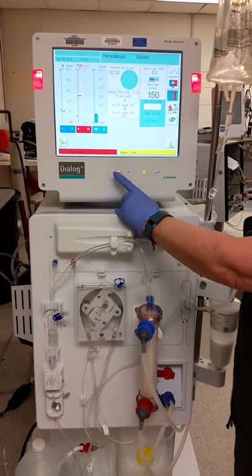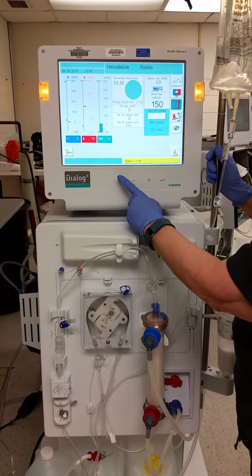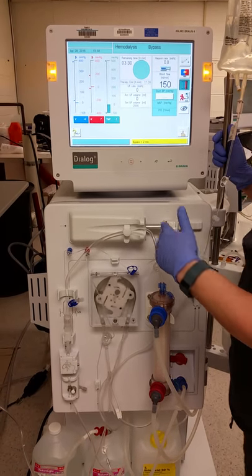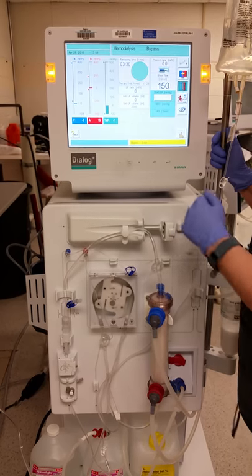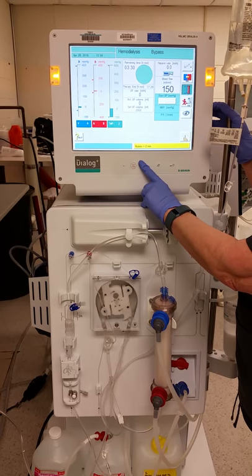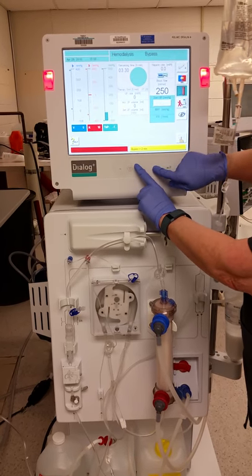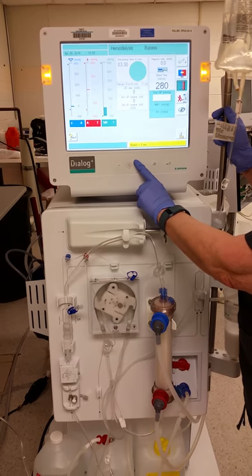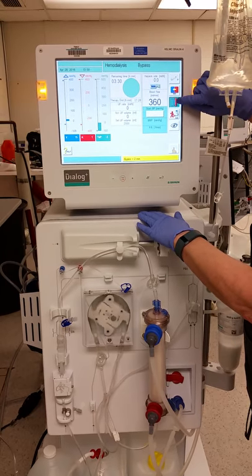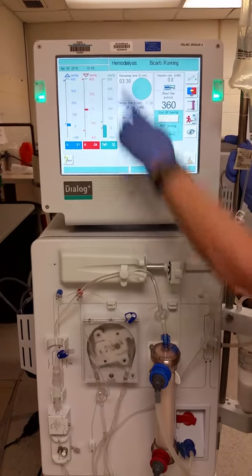Connect to your patient, then open up the clamps for your patient and clear the alarm so the machine will start. Give it a little pressure, clear the alarm, and start the machine. At this point the machine has turned itself down to 150, so watch your pressures and make sure they are half of your blood flow rate or less. Start increasing — if your blood flow is supposed to be 350, increase by about 100 at a time, watching your pressures. Once you reach your ordered blood flow rate of 350, take the machine out of bypass, which starts the clock, and you can see the bicarbonate is now running — you are in hemodialysis.